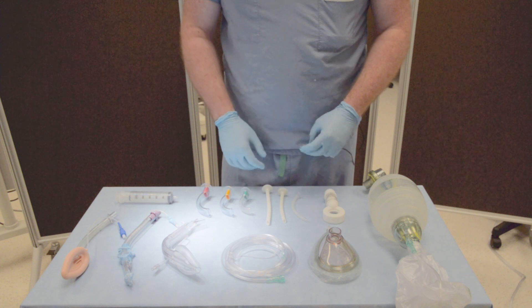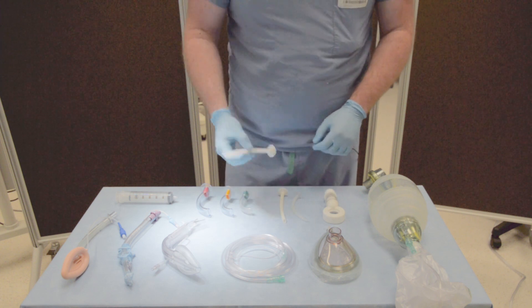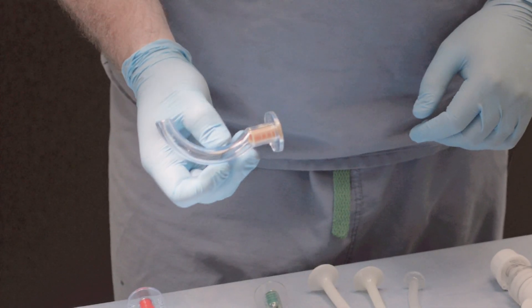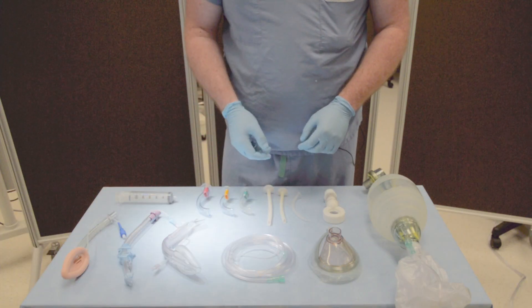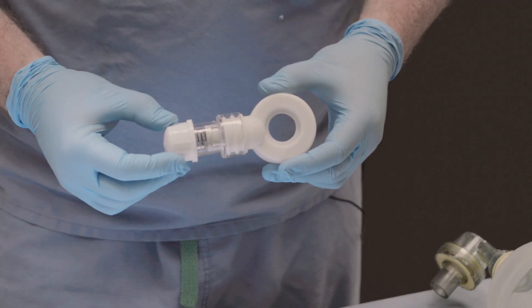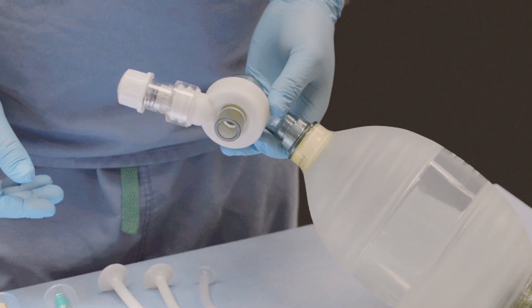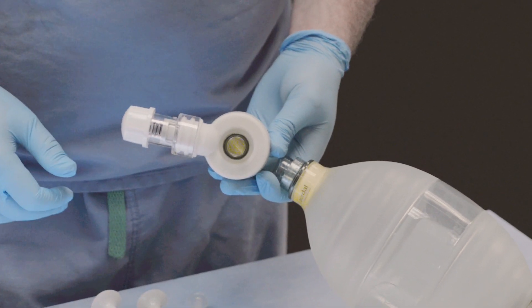The next step is dealing with obstruction. The first is soft tissue obstruction, which we manage with nasal pharyngeal airways — one or more — as well as oral pharyngeal airways appropriately sized for the patient. The second source of obstruction is alveolar obstruction, which we can manage non-invasively with a disposable PEEP valve. This fits onto the bag mask ventilator by snapping snugly together and dialing the cap to the desired level of positive pressure.